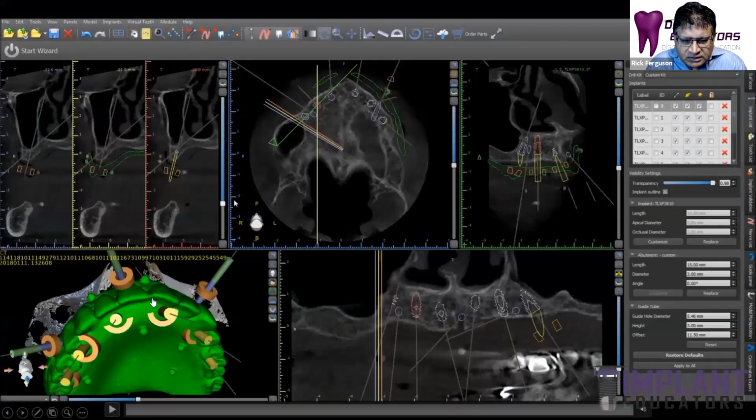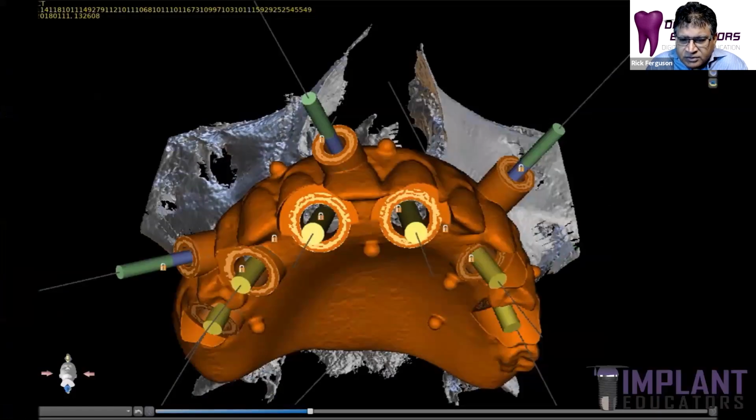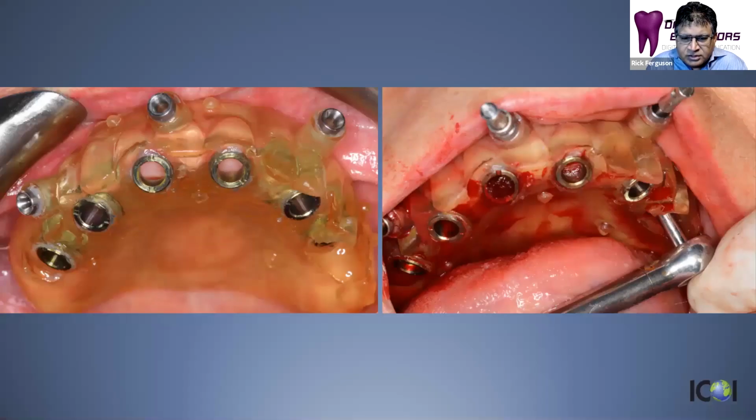We convert the denture into the digital version of the denture, not the patient's actual denture, into a file that then gets converted into a surgical guide. So here we are using that surgical guide, which is fixated in place, and it's indexed by the patient biting it to place. So it's important to leave enough teeth on the denture so that we can have the patient bite it to place and then put in fixation pins. That's how we get the accuracy from this type of a guide.